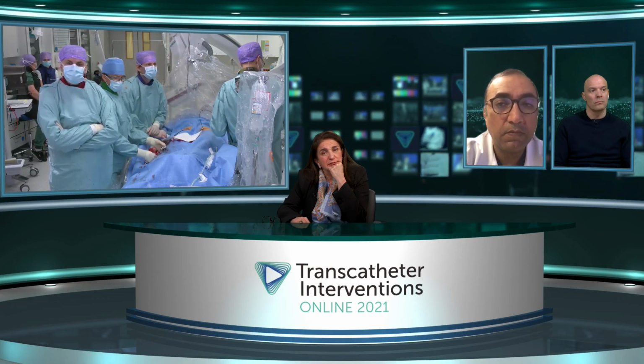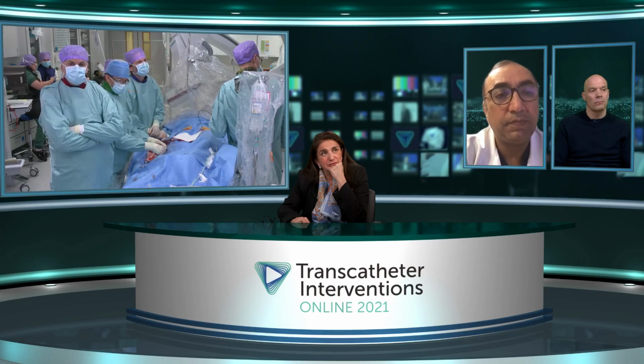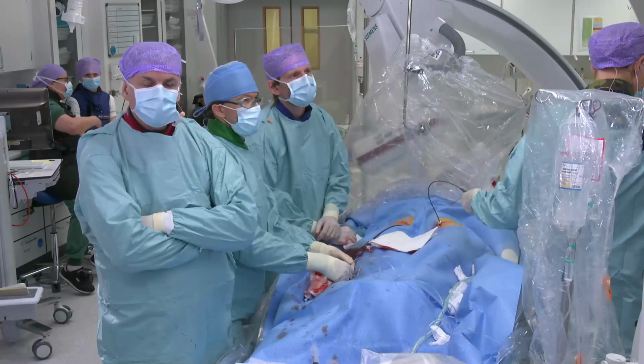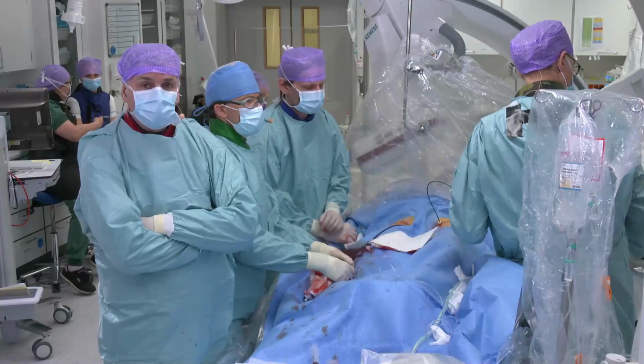I can answer. We haven't seen any issues about it. It should not cause any issues with perforation later on. And also, you have this cylinder inside the cup, so I think it also takes some of the pressure off. So again, it has not been an issue so far.